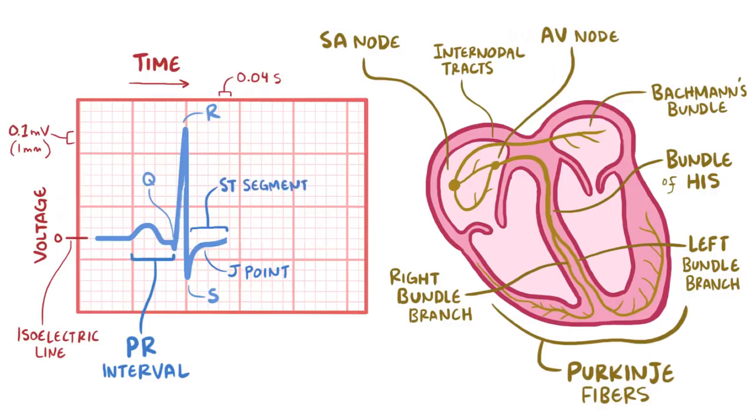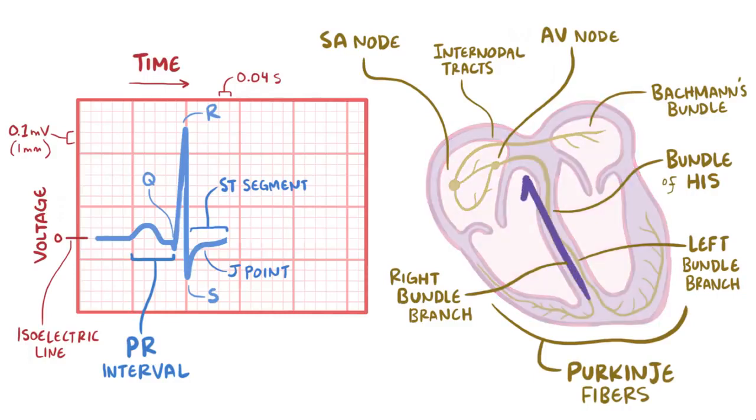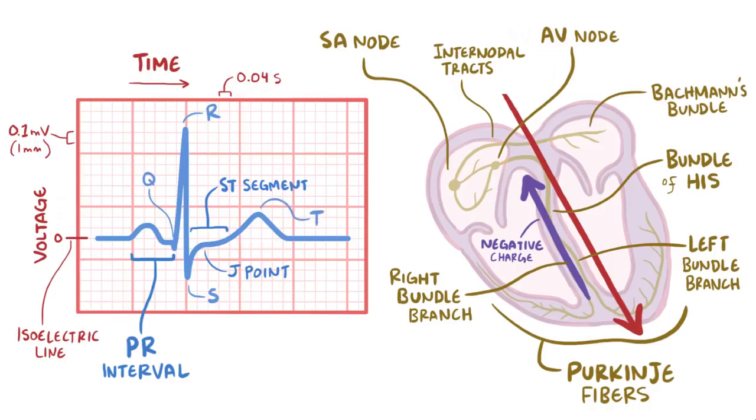After that, the ventricles have to repolarize, or become negative again, to reset in preparation for another wave of depolarization. Now, repolarization moves in an overall direction upward, opposite the direction of lead 2. So you might think that it should be a negative deflection, right? But really it's still a positive deflection, since this time it's a wave of negative charge. So essentially now when it's moving opposite to lead 2, it's a positive deflection on ECG. And this final wave is called the T wave.